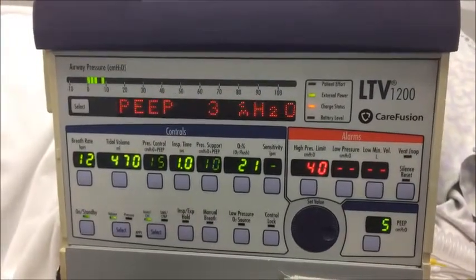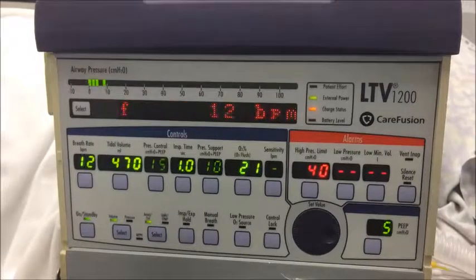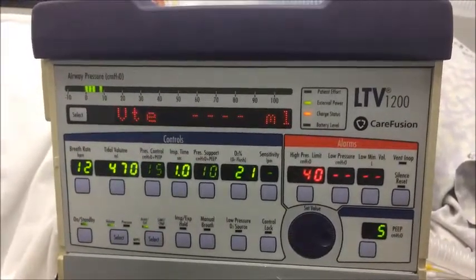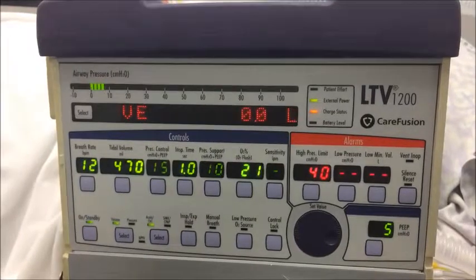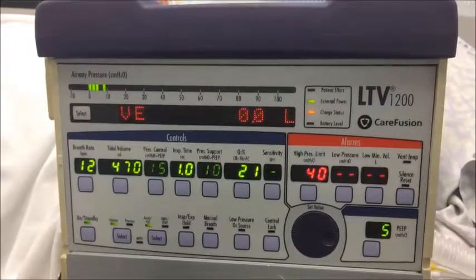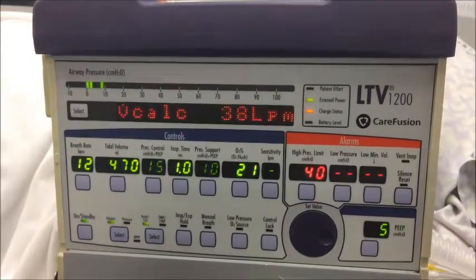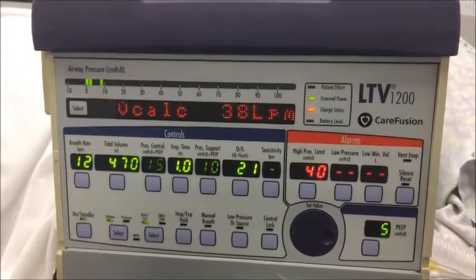During transport with your patient on a mechanical ventilator, you may need to make some adjustments. If you notice a change in patient status, specifically to ventilation or oxygenation, the first thing you want to do is go back to your DOPE mnemonic. Make sure that there isn't an issue with the patency of your tube, your patient condition, your circuit, or any other issue unrelated to the physical settings.